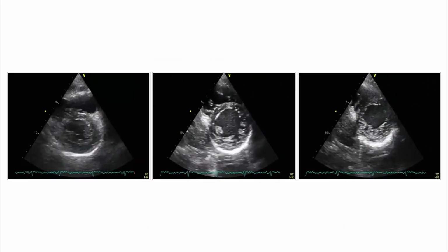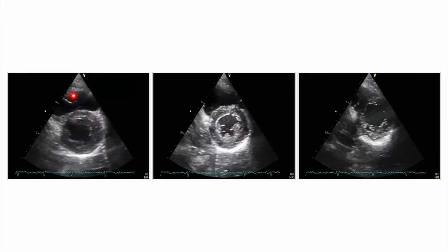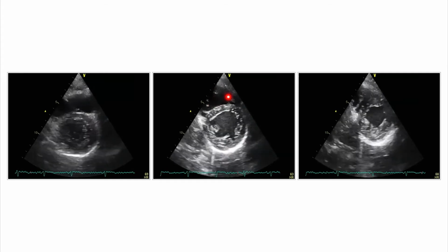And relating to the shape of the ventricle, oval is only one thing that changes when you change the position of the transducer. Here is an example of what happens if you place the transducer at different positions on the chest. If you have it very far cranial, you would have a relatively large right ventricle. But see what happens if I image further down.